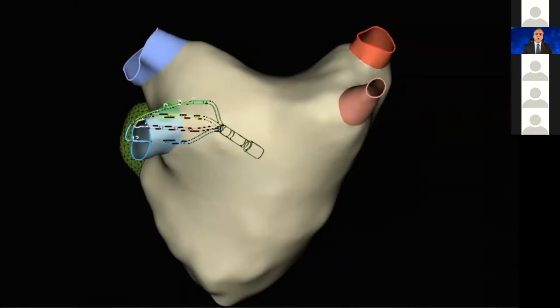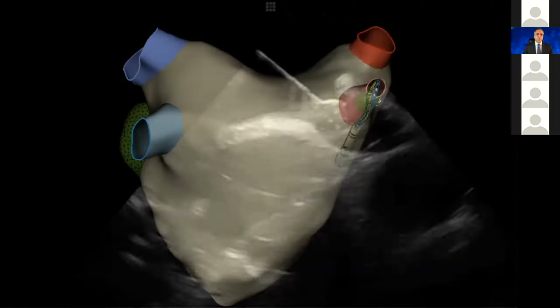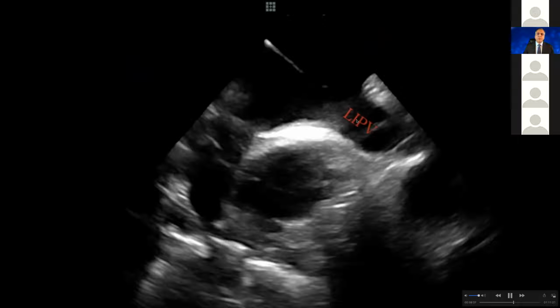How about the floor line? So if you would be able to look at your left inferior pulmonary vein and get to the right inferior pulmonary vein. Here we are getting, this was a case that we are doing the geometry right now, activation with this grid catheter here. And you can see that my catheter is inside the left inferior pulmonary vein, right inferior pulmonary vein. So what is going to be in between? This is going to be the floor line, and this is the descending aorta.